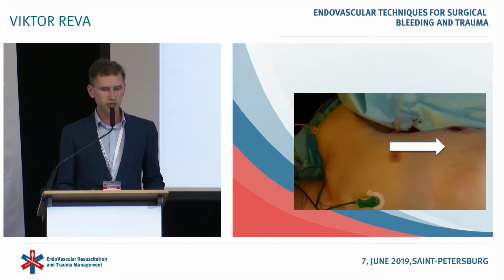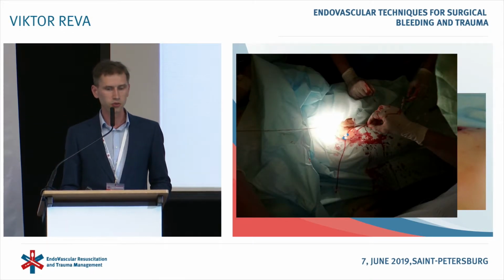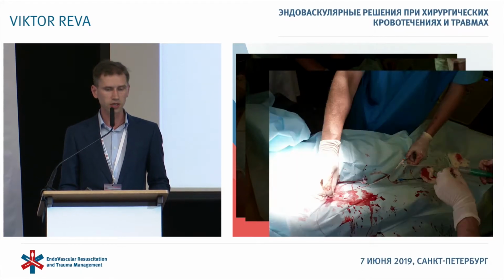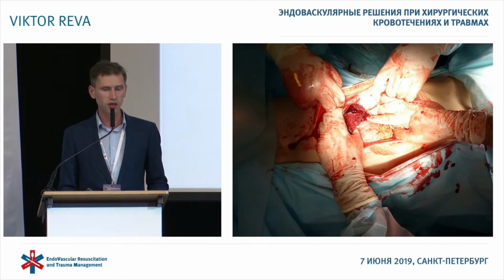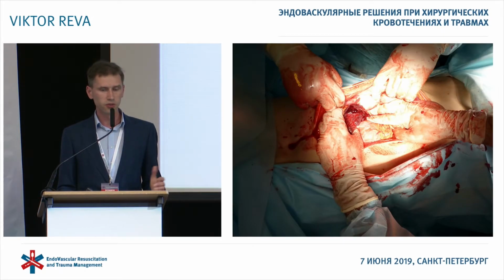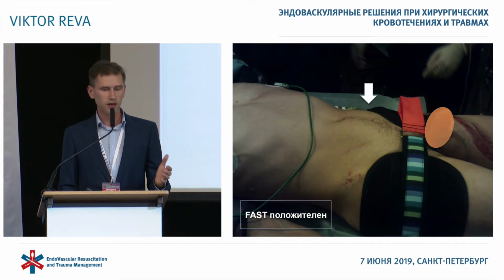stopped. Another case, a thoracic wound and damage to the ribs, spleen, blood loss of around 1.5 liters, balloon occluder, 50 millimeters of mercury. Time of occlusion was 15 minutes. The balloon was removed and the patient discharged.